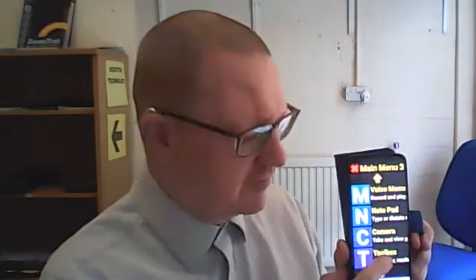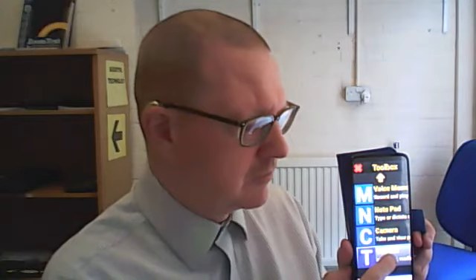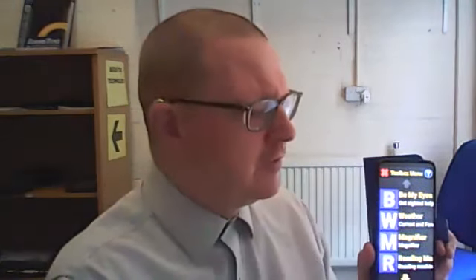In fact, I'm just going to go back to the previous page. Cancel and go back. Main menu. Page 3 of 5. The thing at the bottom here called Toolbox. Toolbox, magnifier, reading machine, etc. I'm going to go into that one. Toolbox menu. Page 1 of 5. So in here, I've got some very useful tools where I can use the phone as a magnifier.